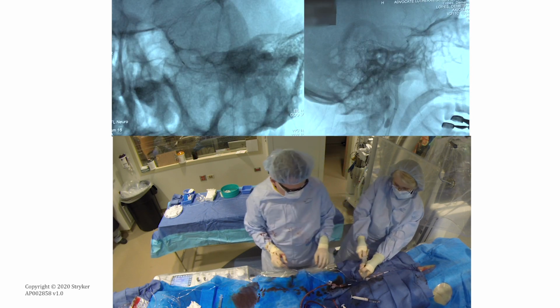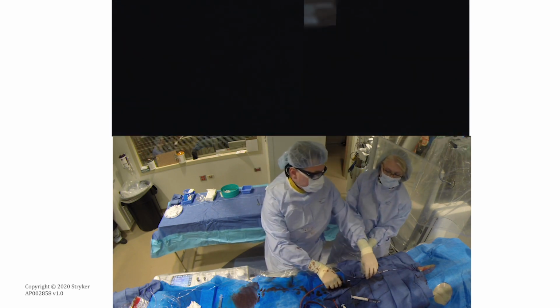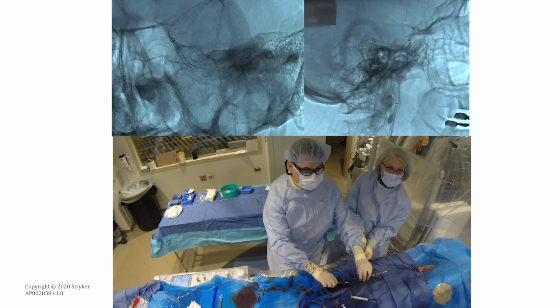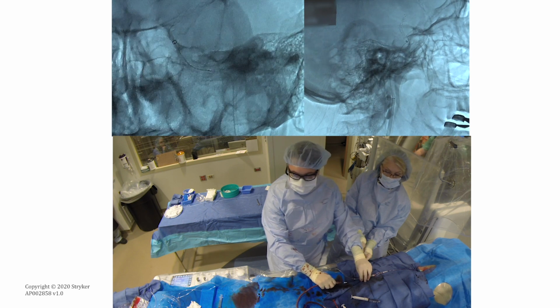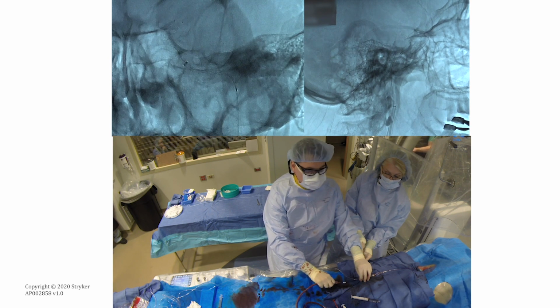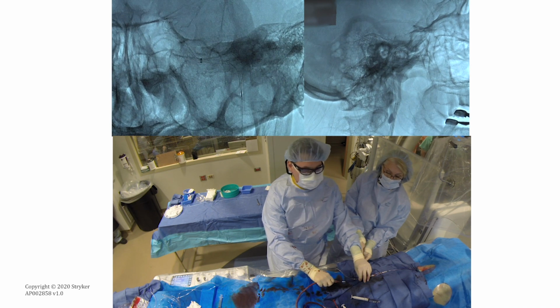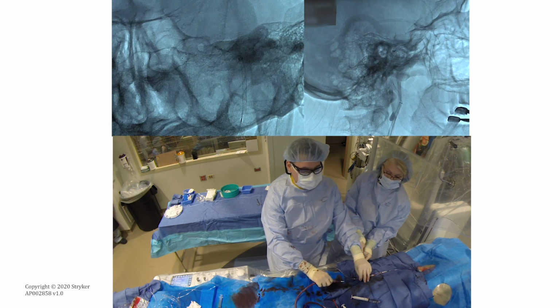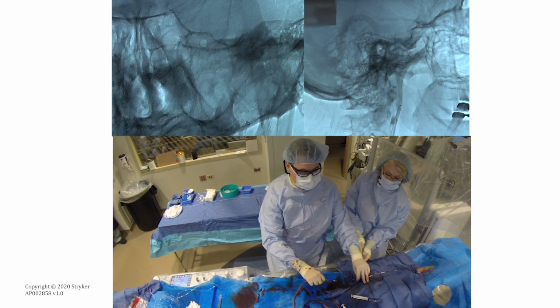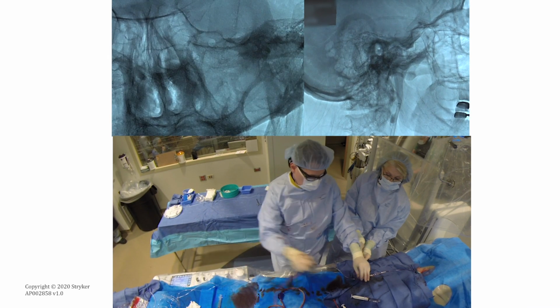Meanwhile, this is a time that you're letting the clot integrate with the stent retriever, and the intermediate catheter, or Cat 7, is aspirating the clot proximally at the level of the proximal portion of the clot. And now you see the two hands, how you gently pull the system together. Here I think you feel you have total control of the situation, because you have your balloon guide in position, not allowing any distal embolization, and you have the clot trapped between the Cat 7 and the Trevo stent retriever.